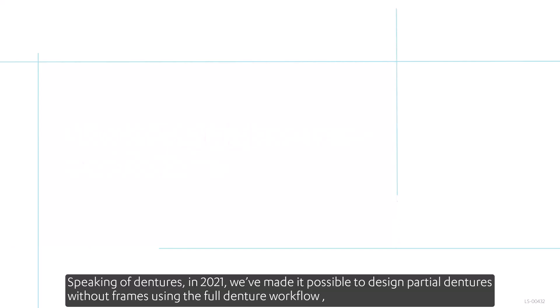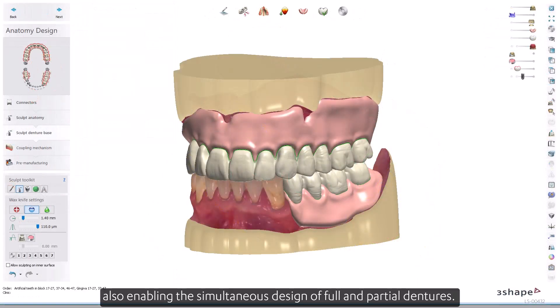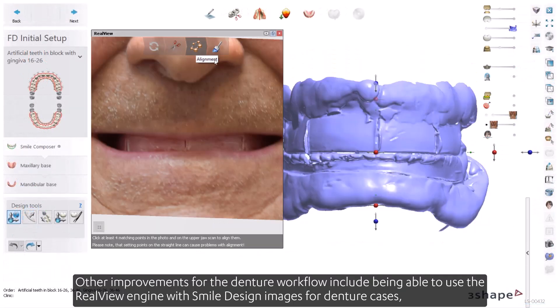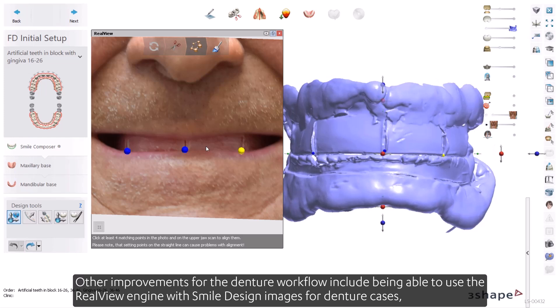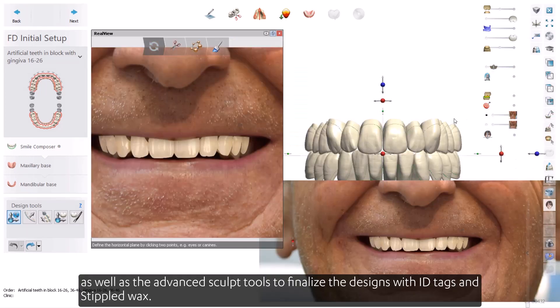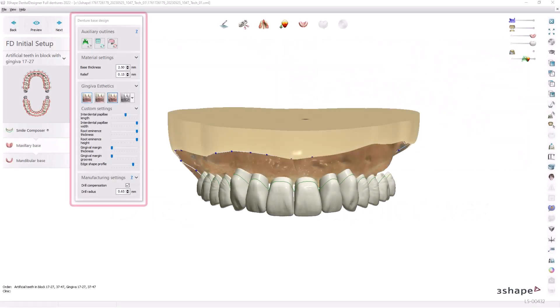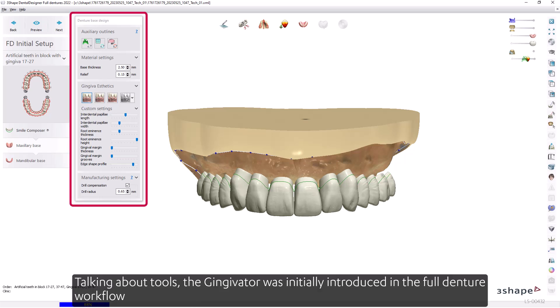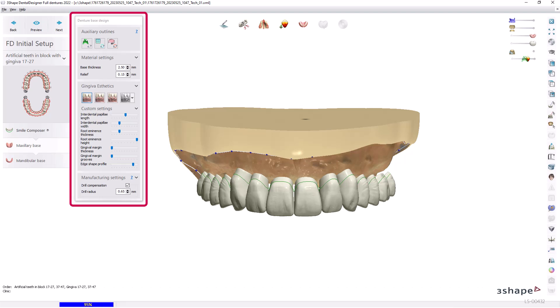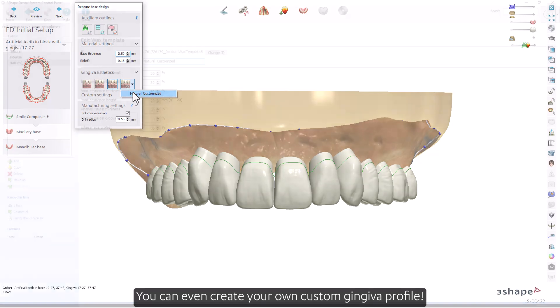In 2021, we made it possible to design partial dentures without frames using the full denture workflow, also enabling the simultaneous design of full and partial dentures. Other improvements for the denture workflow include using the Real View engine with smile design images for denture cases, advanced sculpt tools to finalize designs with ID tags and stippled wax. The Gingivator was introduced in the full denture workflow, giving full control over denture gingiva contours with presets, easy adjustment options, and the ability to create custom gingiva profiles.